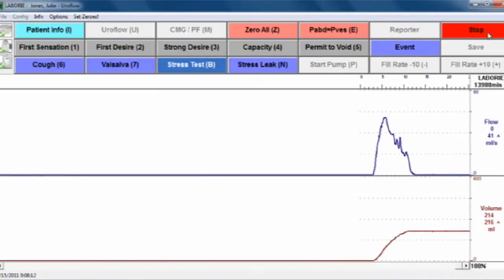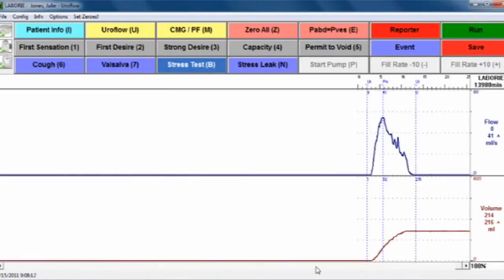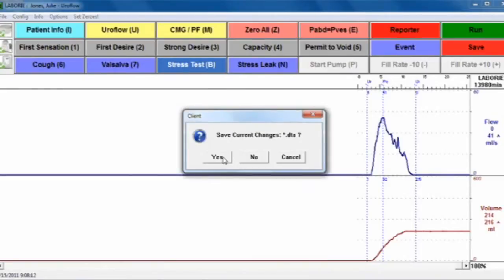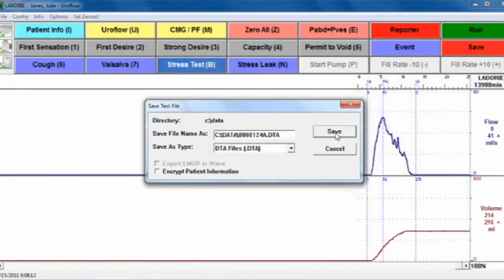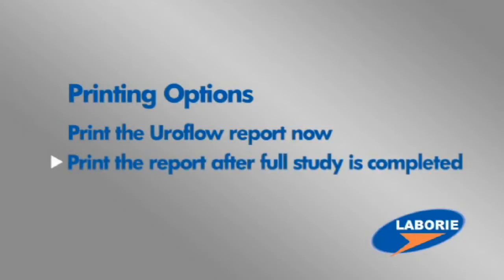Once the test has stopped, a window will pop up prompting you to record the post-void residual. This is where you'll document the residual volume once known. Next, click the Save button. Then you'll be given the option to print the report, or you can simply wait and print everything once the full study is complete.